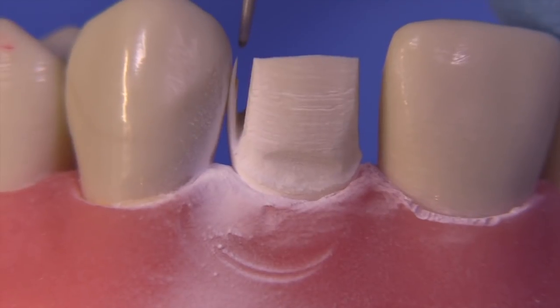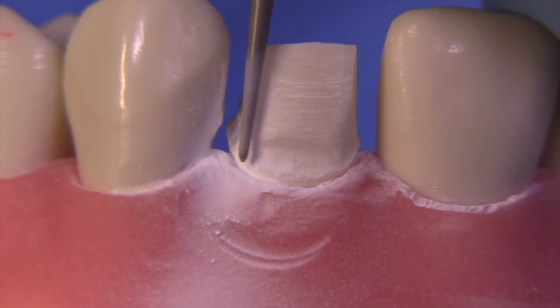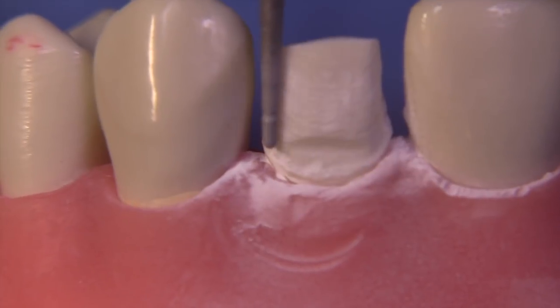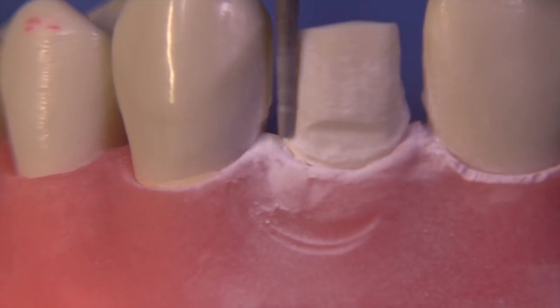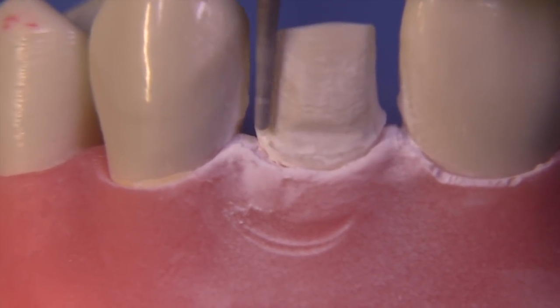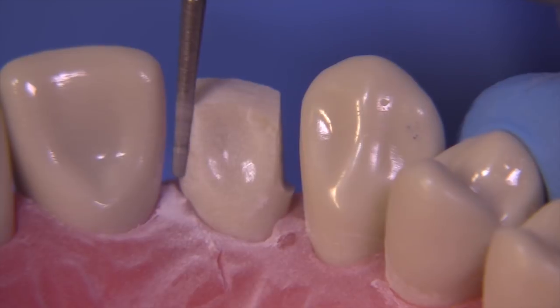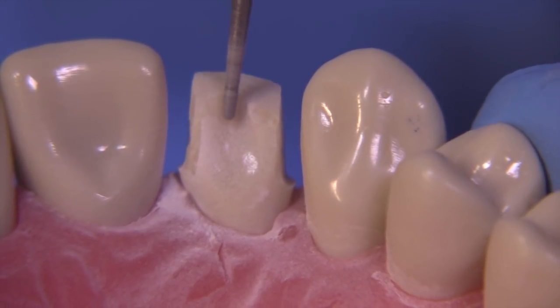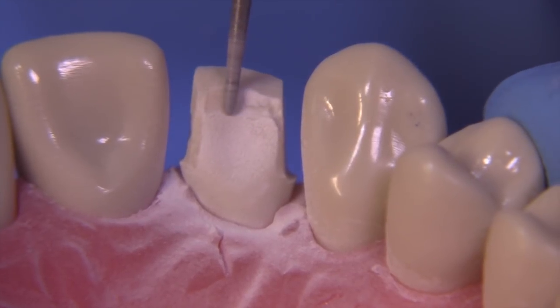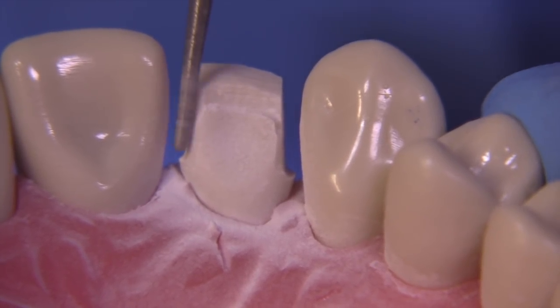It's amazing how easy it is to use this interproximal burr without hitting the adjacent tooth — it just slips right in there quite easily. You can also use this for full crown preparations. We've switched over to the LVS3-016; the tip of this burr is going to be utilized to form the modified shoulder, or the rounded internal shoulder. We want the angle between the shoulder and the unprepared tooth to be approximately 90 degrees, but the internal angle should be rounded. We're using the same burr to extend beyond the margins of the previous class 3 restoration, then going across the lingual to create a very robust, tall lingual shelf to hang on to.